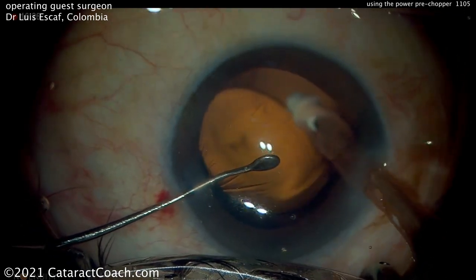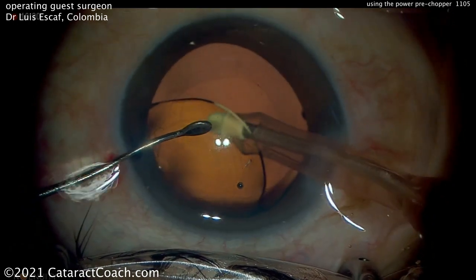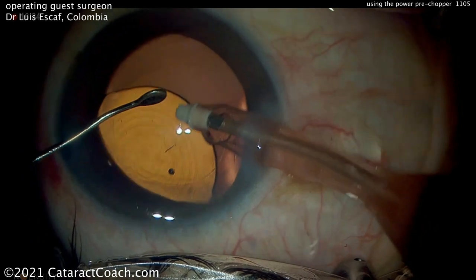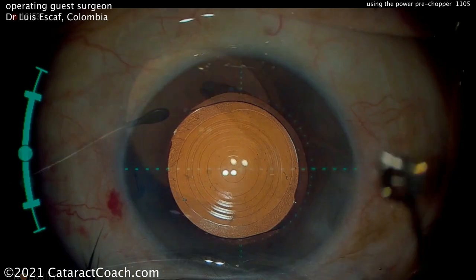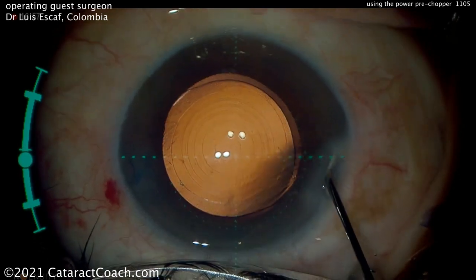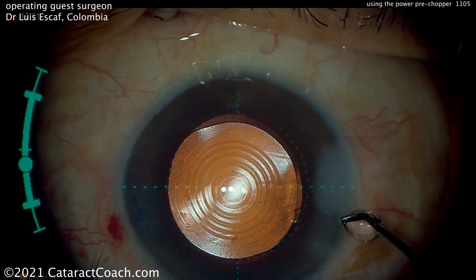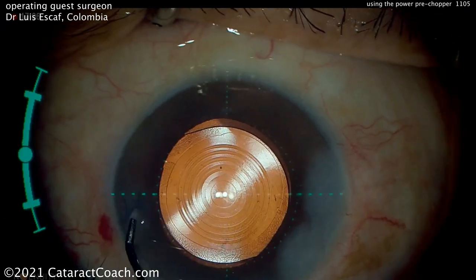But you can see it's very important to get that center of the trifocal lens beautifully aligned. We typically do it using the Purkinje images. And then we do check patients in the pre-op period to make sure there's no excessive angle alpha or angle kappa. Important there — removing all that viscoelastic from behind the lens. That looks great. And here you can see centration. Look at the Purkinje images beautifully lined up. And the overlay agrees with us and says that looks perfect. Patient had a beautiful outcome. And you can see that capsulorhexis overlaps the optic very nicely.